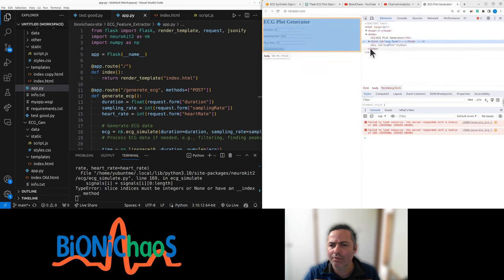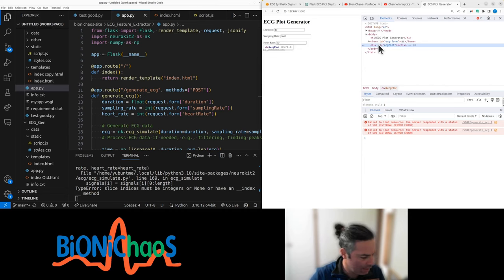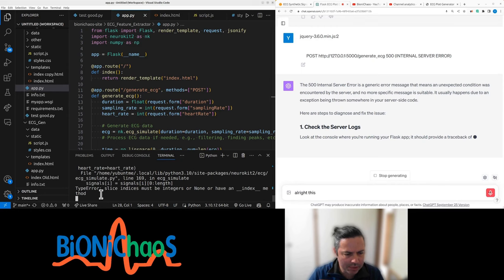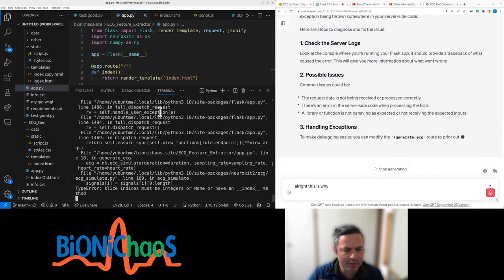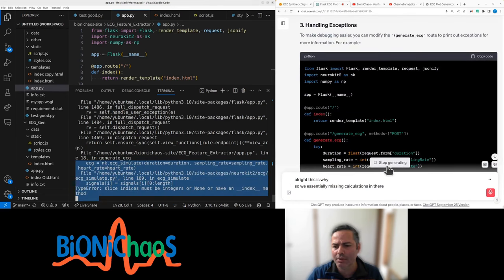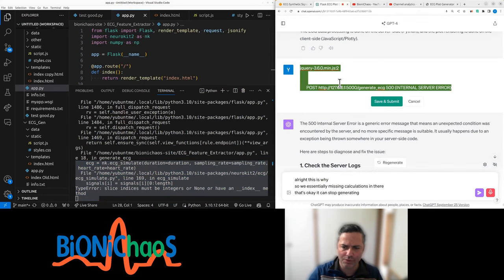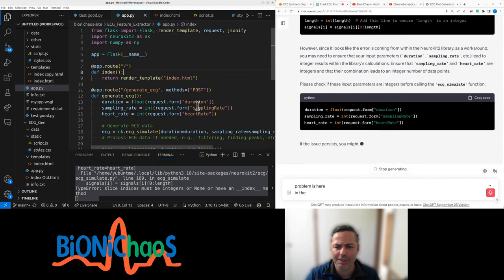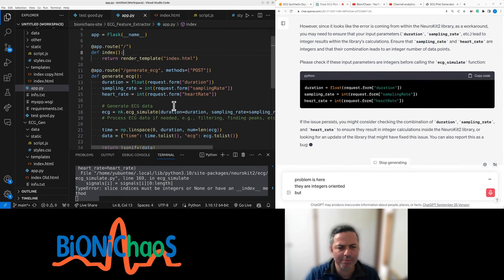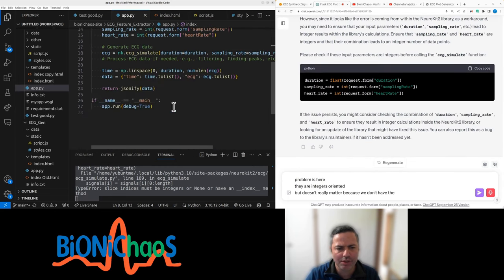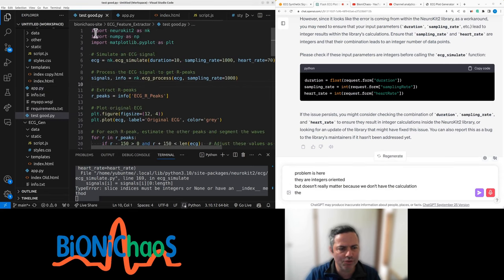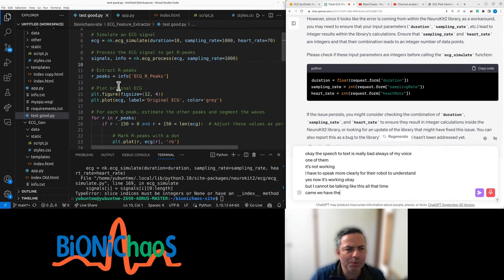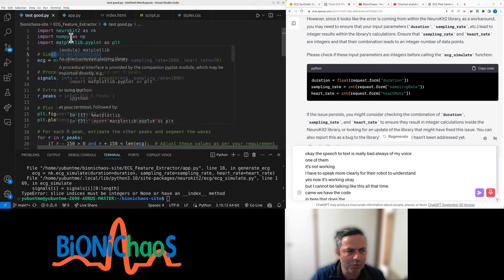First, let's see if we have the plot. That's the form. That's the plot, you can barely see it, it's almost not there. We'll make it visible in a second. Generate ECG gets a 500 error. This is why. We're essentially missing calculations in there. That's okay. The actual problem is here, there are integers already on there. It doesn't really matter because we don't have the calculation.